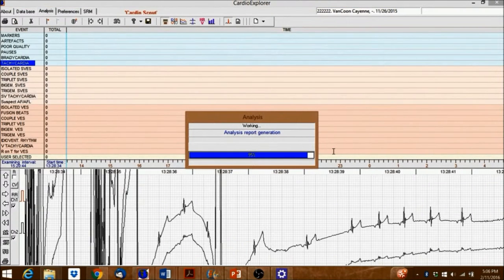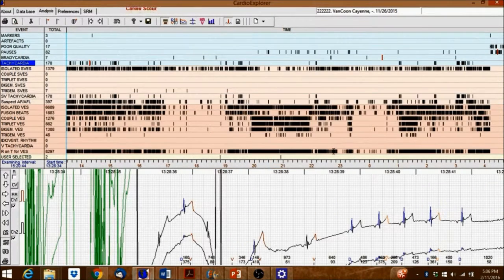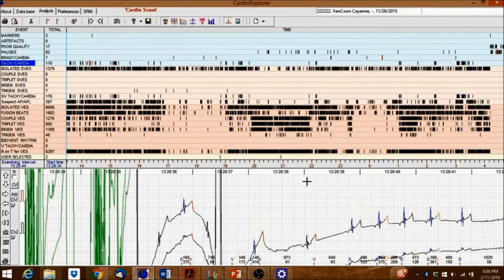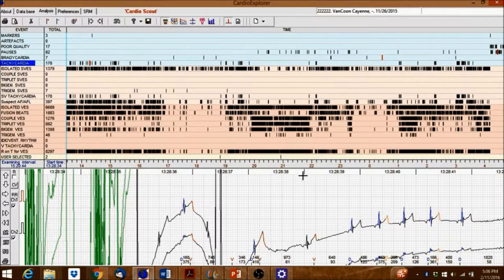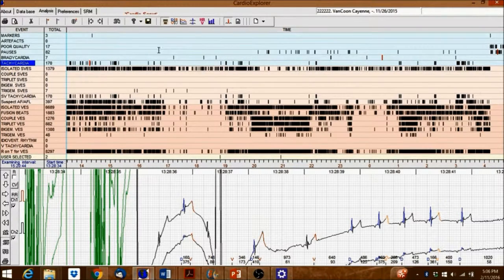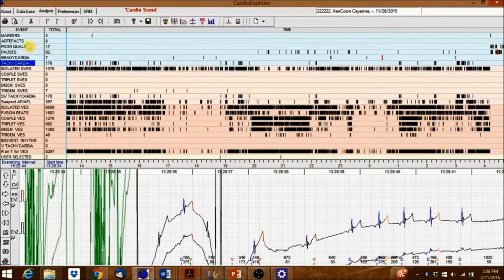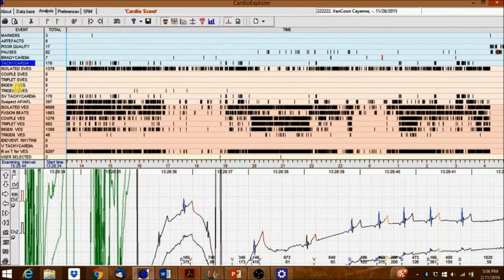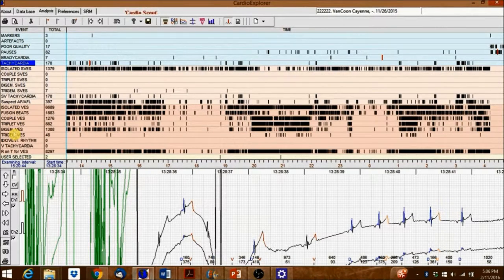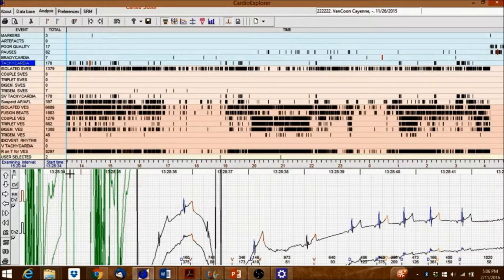The Analysis tab opens, showing the Event Overview screen with all detected events in their respective categories. These events are categorized based on the settings in the Analysis Preferences.